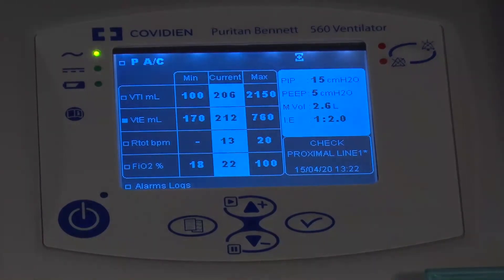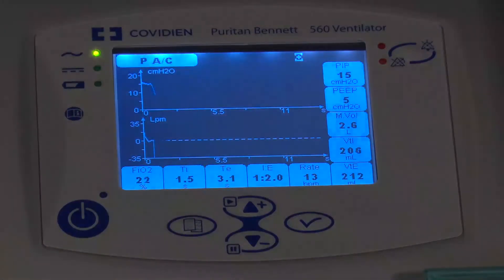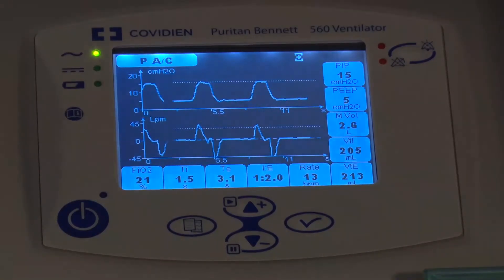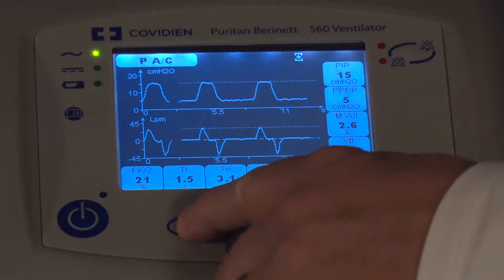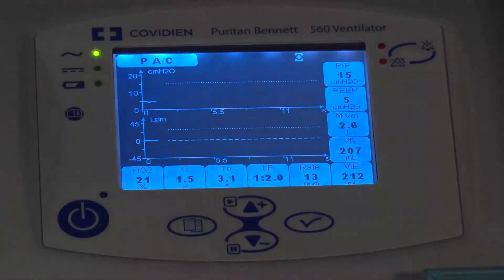Moving on — pressing the menu key cycles past alarms to the waveform screen. On the waveform screen you get a display of the current mode, a pressure waveform, and a flow waveform. These waveforms will auto-scale in about three breaths. You also see all patient data information displayed here. There are basically three screens when working through the normal menu: the primary setting screen, the alarm screen, and the waveform screen.